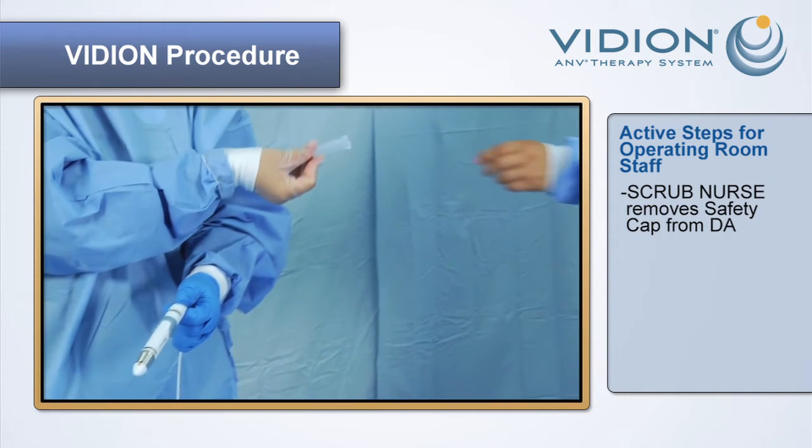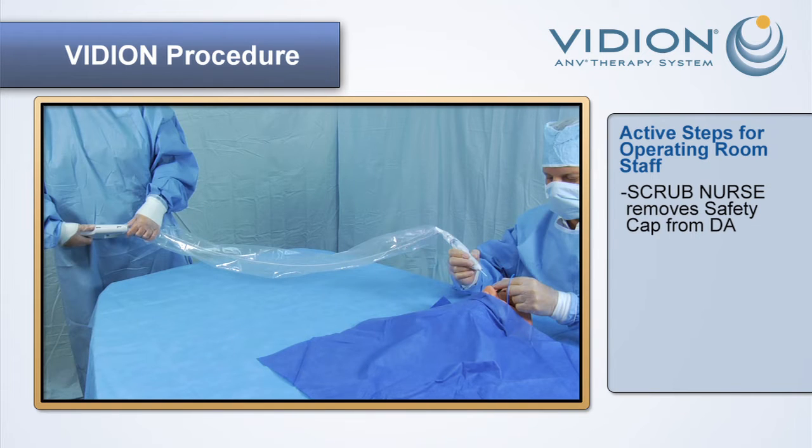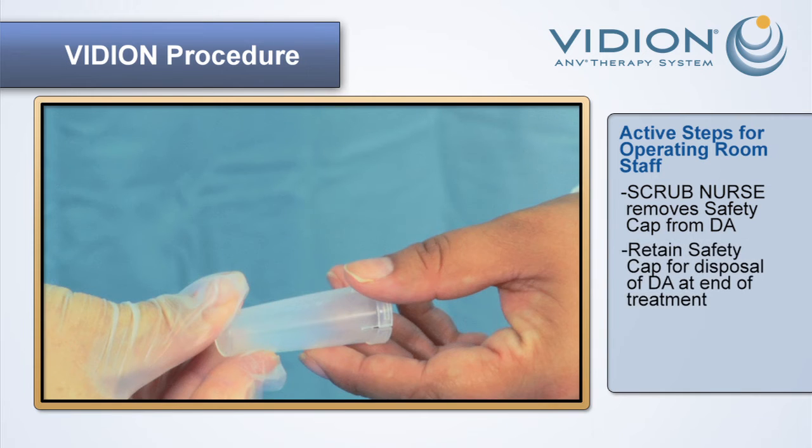This only applies when the RDM has been sterilized. If a sheath is being used, the safety cap has already been removed. Retain the safety cap for removal and disposal of the disposable applicator at the end of treatment.